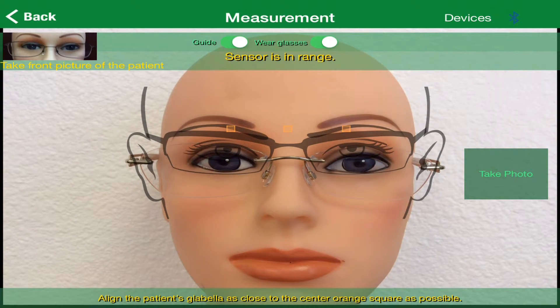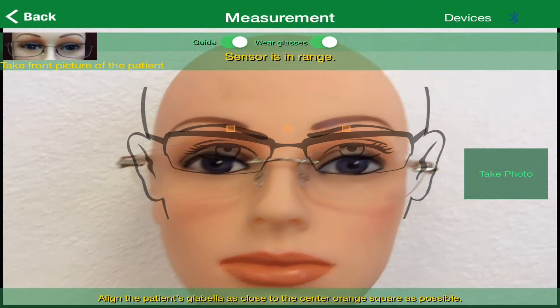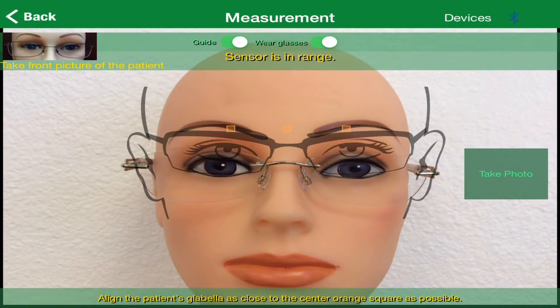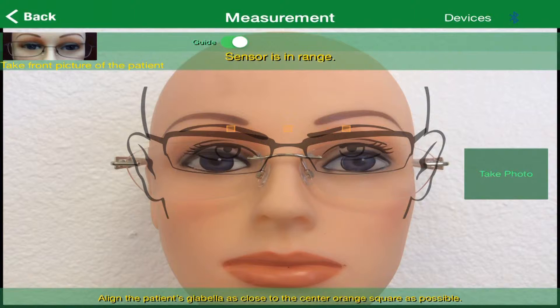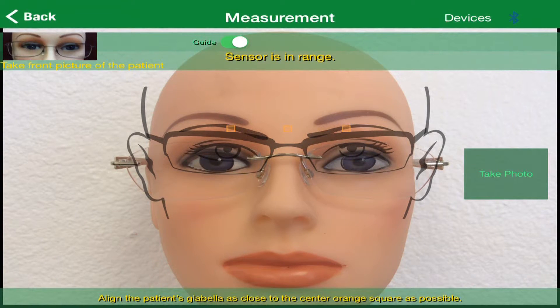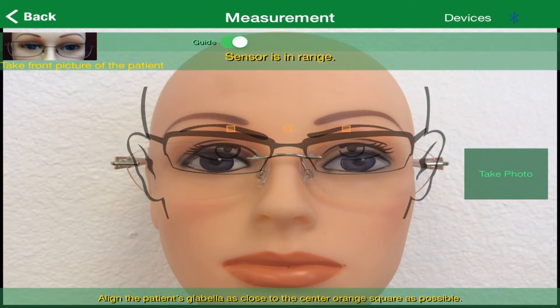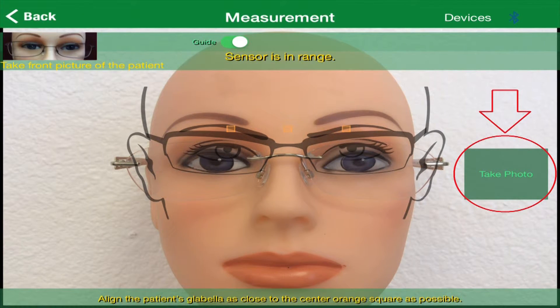For training purposes, we're going to leave the Guide and Wear Glasses options on, so make sure the white dot on each is moved to the right. Once you have the patient's eyes lined up as close as you can to the eyes in the transparent guide model's glasses, press the Take Photo box on the right of the screen.